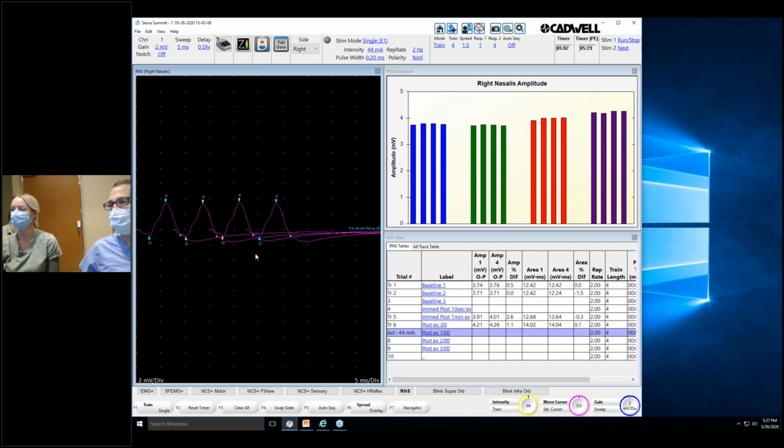And that certainly may be true. I don't know if it was that paper or not. I think it was a different paper that also showed that the deltoid has more technical problems. In fact, I think I have a slide showing that, but in one study, that nerve had to be repeated more often because of technical issues. So we don't routinely do that. We usually stick with the spinal accessory. If the patient is weak in the deltoid, and that's a weaker muscle, then occasionally we would perform rep stim on that. You also can perform it on the biceps too. But I think because of technical problems when you're stimulating Erb's point, all the muscles in the upper trunk are moving, and it's a bit harder to stabilize that muscle.